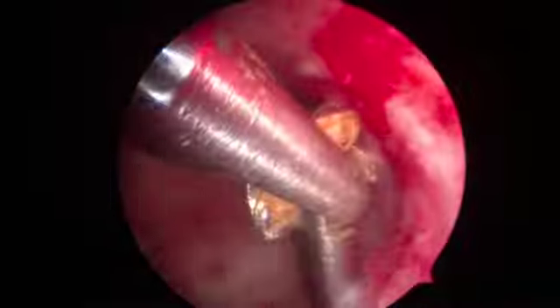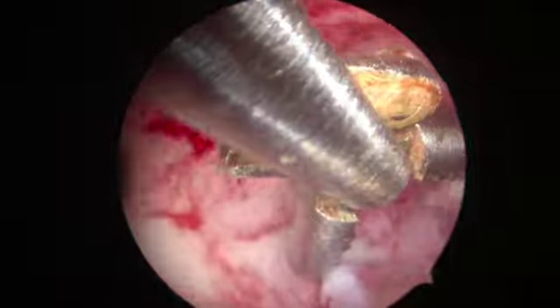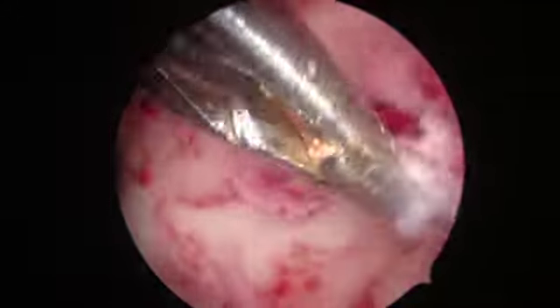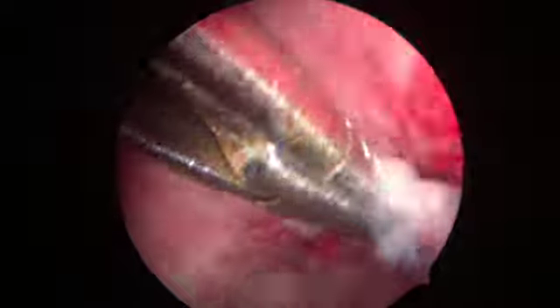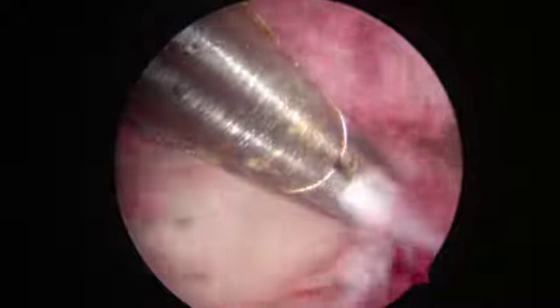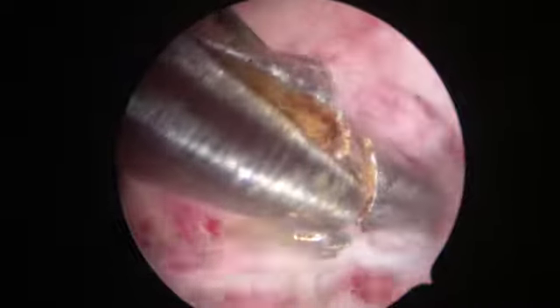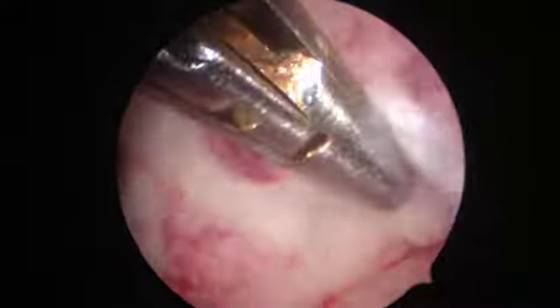Another alternative in such a case would have been using the tissue retrieval system and completely under vision doing a visual D&C of this part. But if you don't have a tissue retrieval system, still you can do a proper job with the help of a grasper. The only restriction is that you have to go in multiple times and retrieve the tissue slowly and steadily.